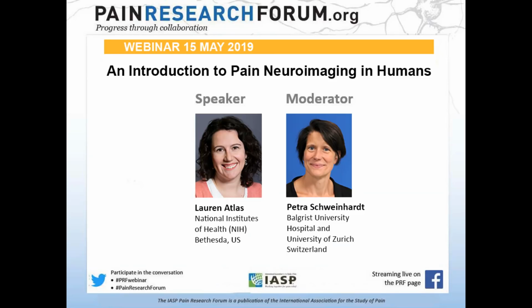data. Because sometimes, the reason that I showed that package from AFNI is because I first learned how to do fMRI with AFNI in 2003 when there were no default assumptions. And so we had to make decisions about how to build our pipelines by looking at effects on the level of a single voxel. And as I moved to other software that has default assumptions, it becomes really easy to just click the buttons and get some kind of statistical map in the end, but not know that half of the brain was missing, or there are spikes, there are all these kinds of things. So if there are ways for us to maybe not publish, but at least host openly the quality of the data, I think that would be great. Yeah, make available. Great, thank you.